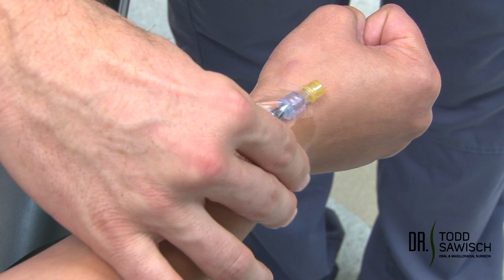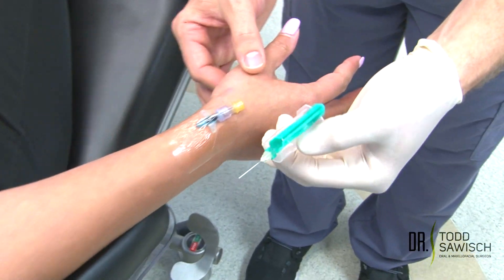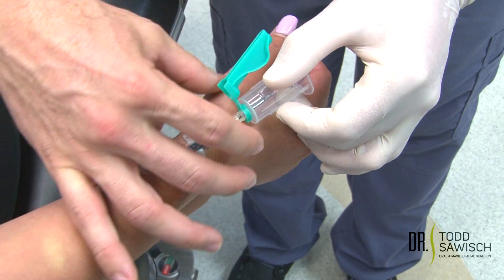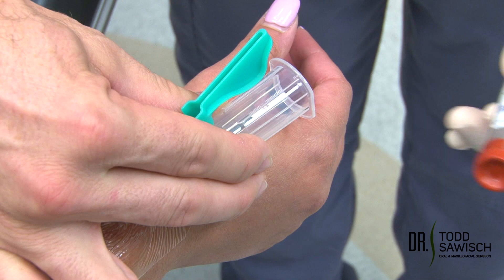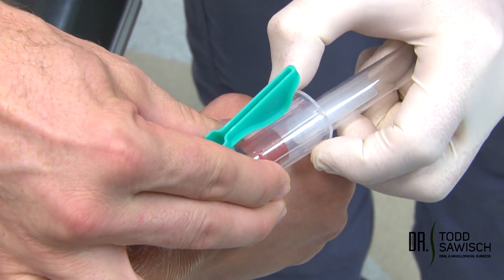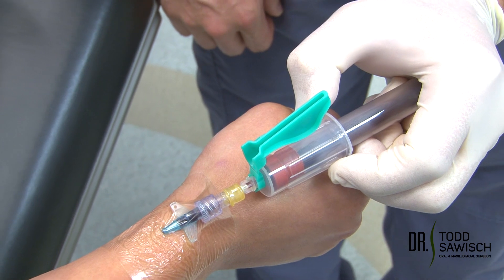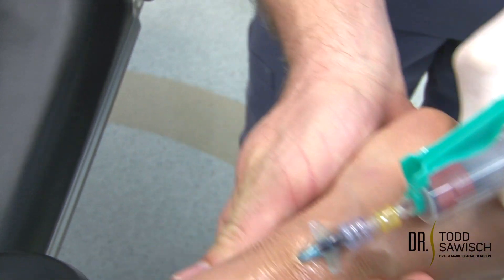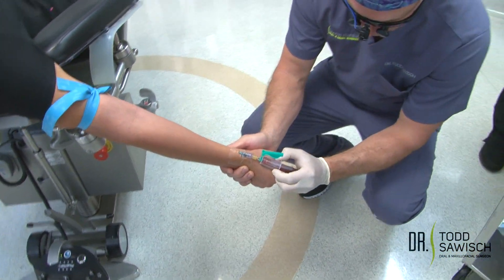The tourniquet is still on. The patient is going to open her hand. This is what we call a vacuette — this allows us to draw blood into the tubes. We're going to insert this into the button, stabilize, and then insert the vacutainer tube. You're going to see blood come into the tube by the pressure — this is how we draw the blood we need for the PRF. If this becomes problematic, you can always bring the patient's arm over to the side so that it's lower than the heart, and it will fill up faster.